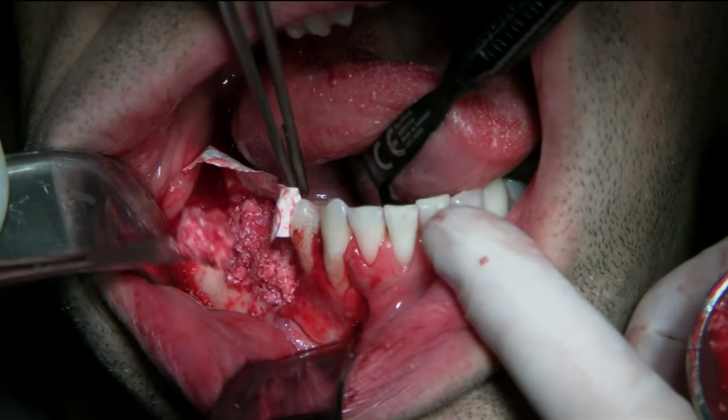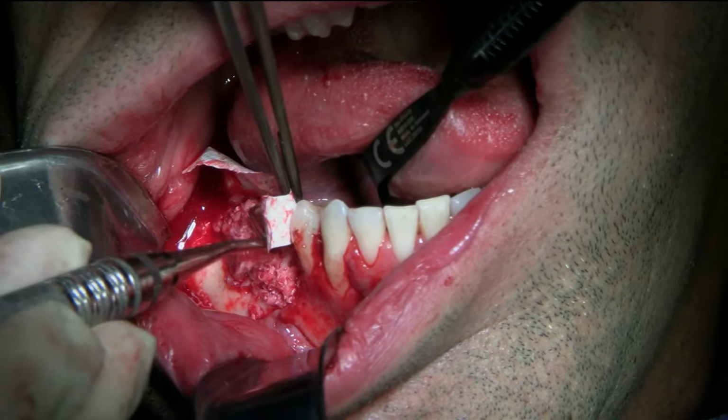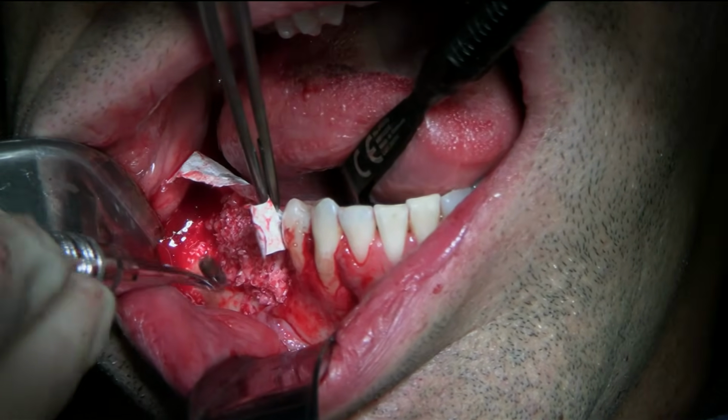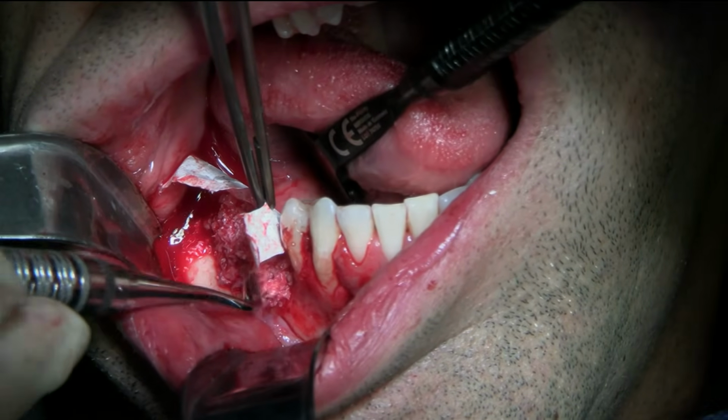You can see that our harvest was great. Can you suction at the base of the bone? A little bit, but not too much, because I can use that blood. Saliva you can for sure suction.